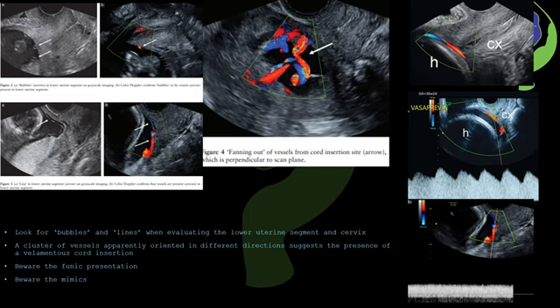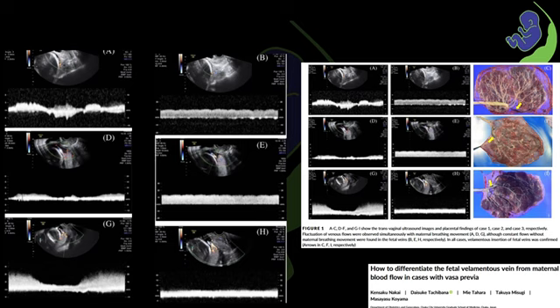If the flow pattern is venous, then we need to differentiate from a maternal venous channel. As you see in the figure, the maternal veins will show fluctuating flow varying with maternal respiration or pressure changes. Fetal veins, on the other hand, show a constant steady waveform completely independent of the maternal breathing.